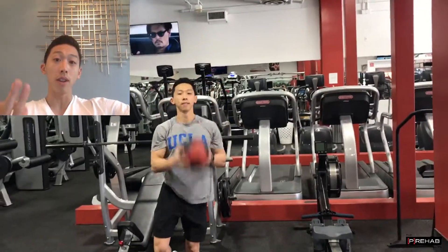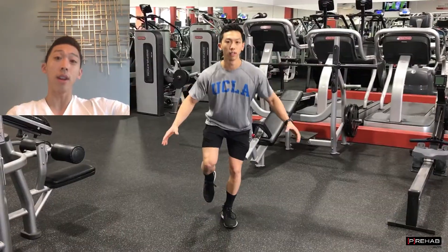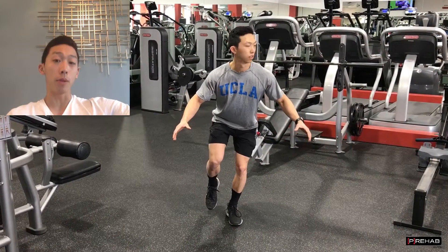Essentially, balance is made out of three components — vestibular, vision, and sensory — and they were altering all of them in order to improve people's balance.